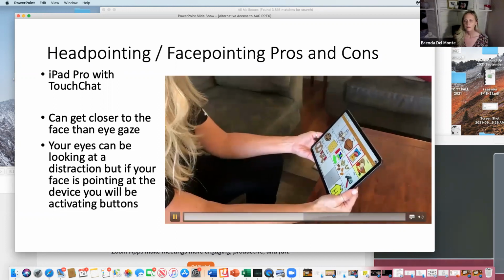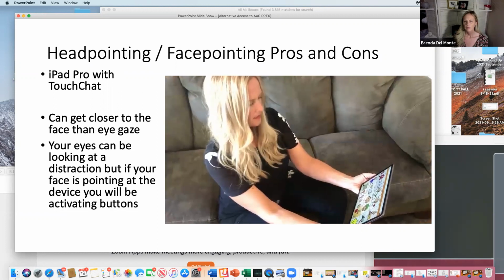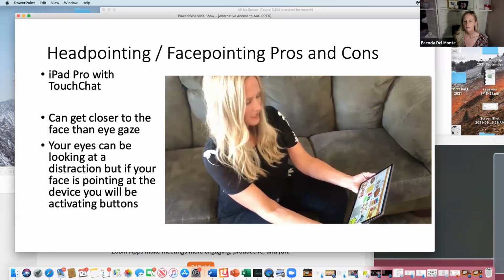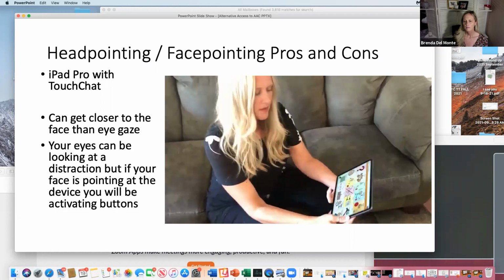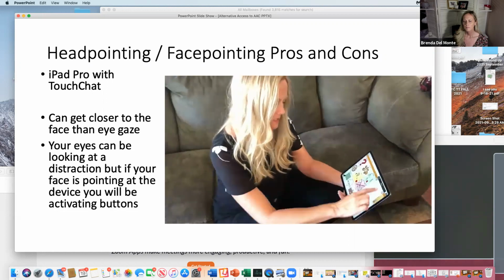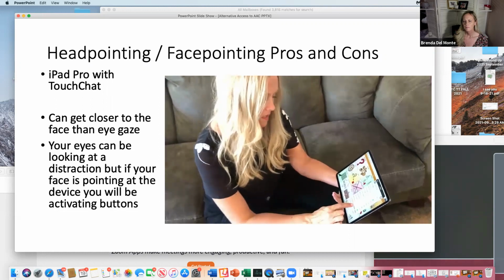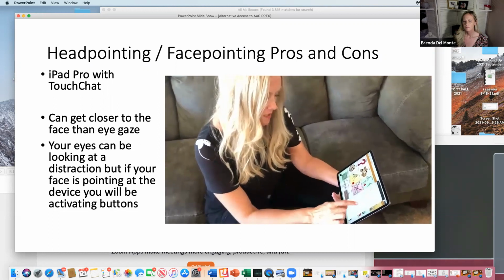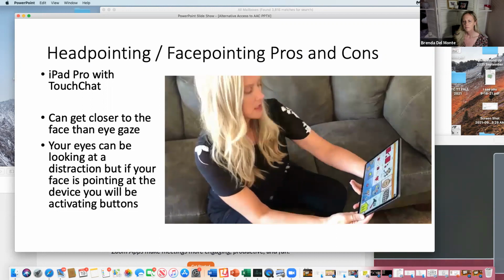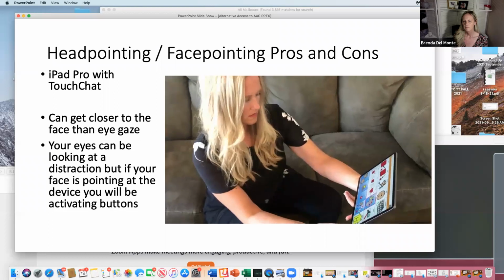Chips. I want to eat chips. If I put it on blink, it works the same way. Settings, enable head point is on. My trigger action can be blink. I'm going to go to colors. Orange, blue, yellow, pink. And I can trigger with all those different actions.